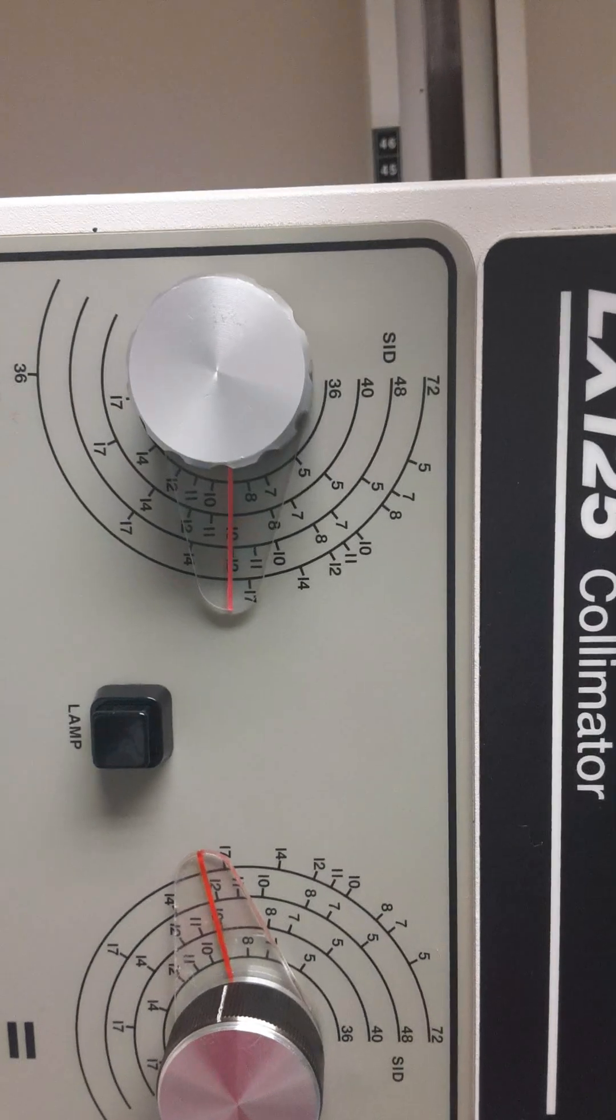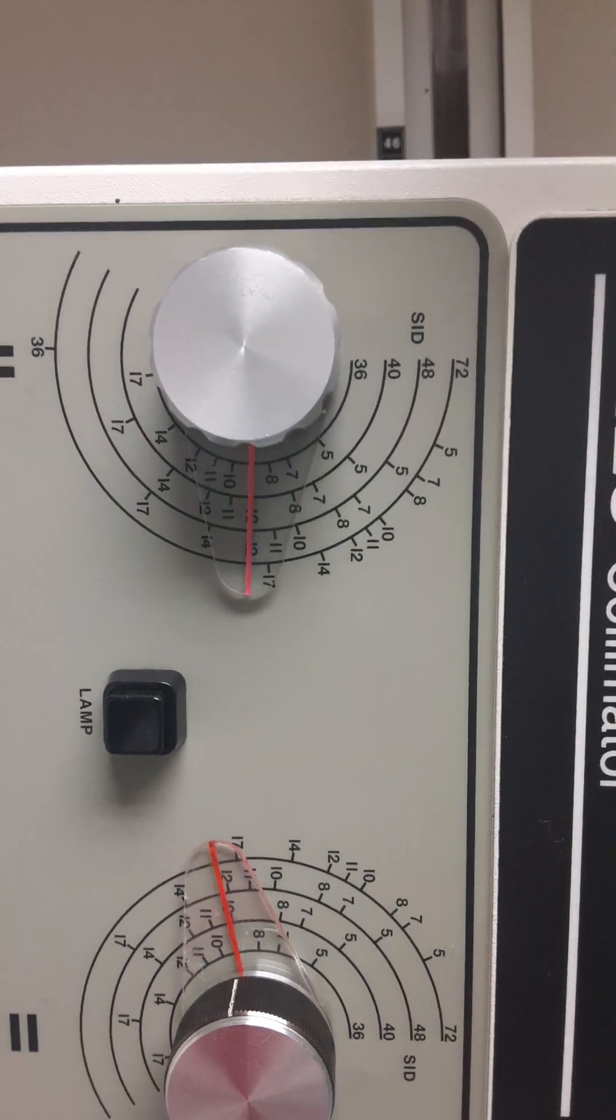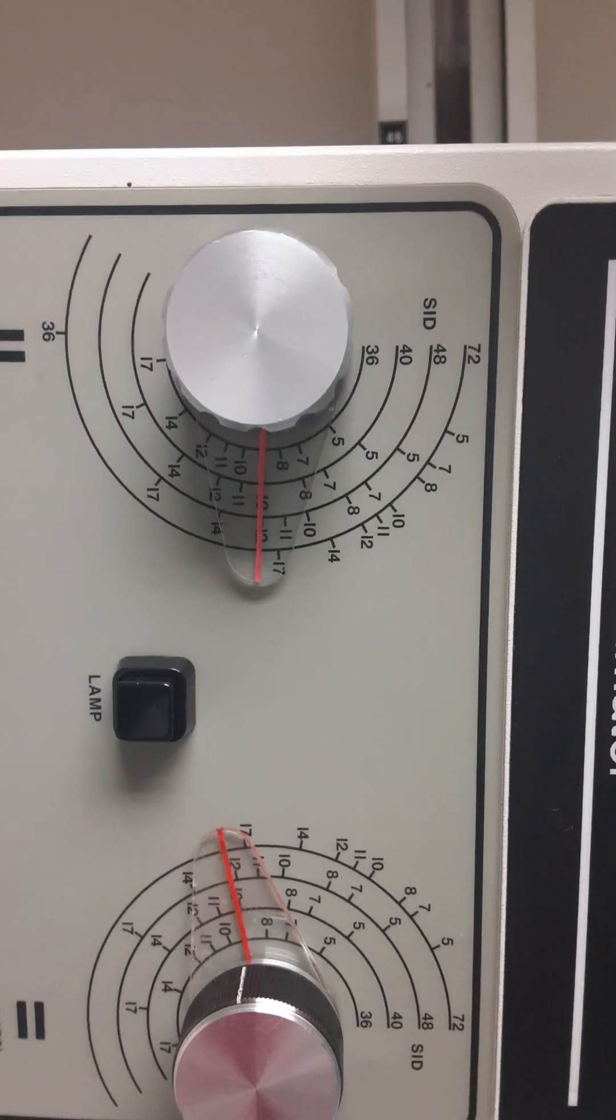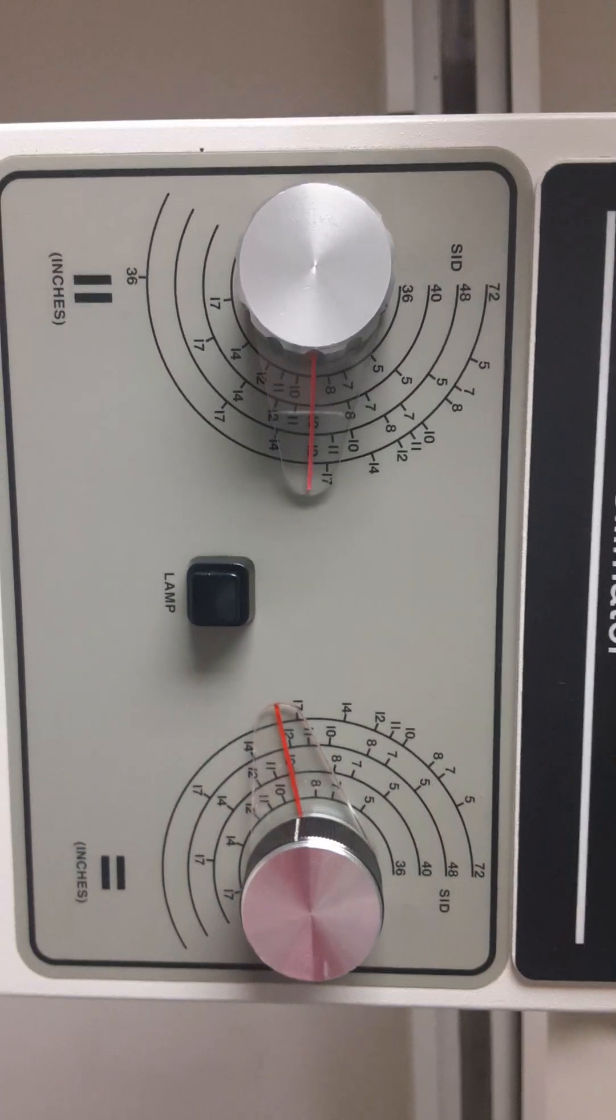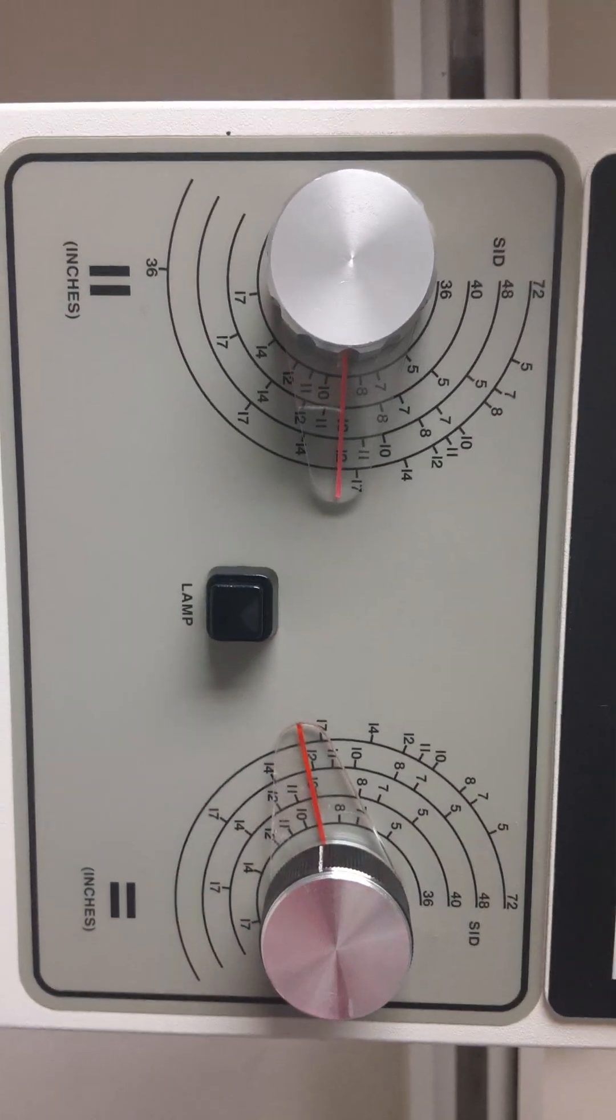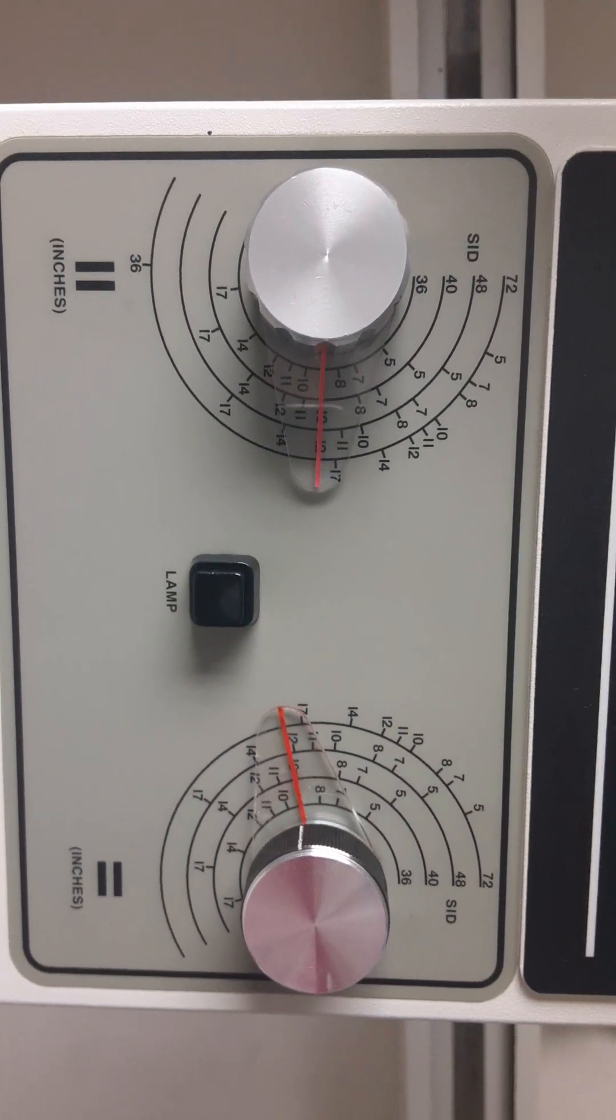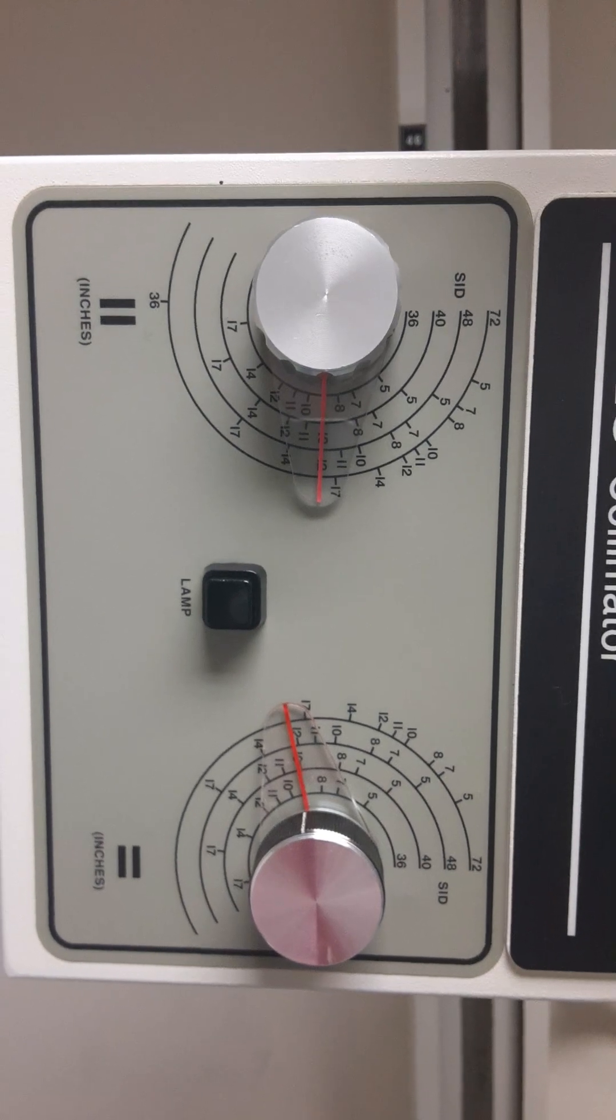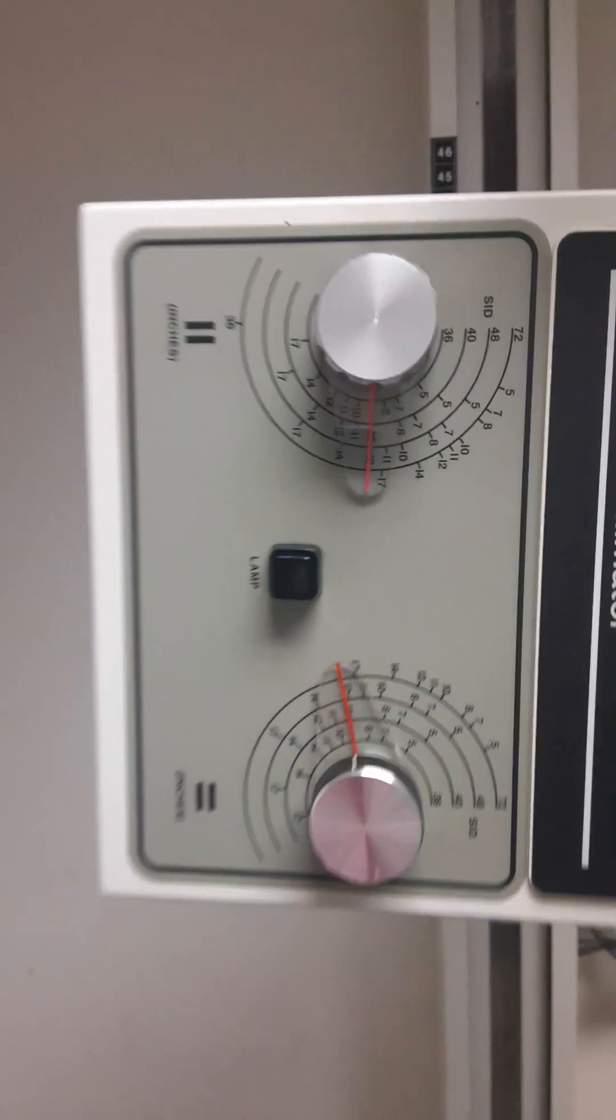We're going by that little line for 40 inches for whatever our collimation needs to be. These tell you if it's moving up and down or side to side, but I just watch the light on the actual bucky itself.